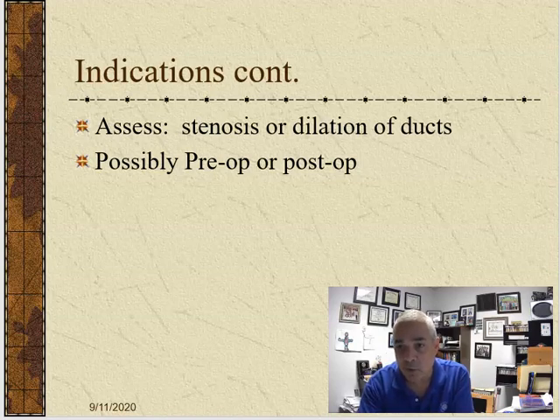And then post-op, we do this sometimes to see if, once the doctor's in there and maybe they've taken out part of the liver or something like that, bile is leaking into the peritoneum, because if it is, that can cause a big problem for the patient. That can cause you to get peritonitis, and it can be life-threatening.